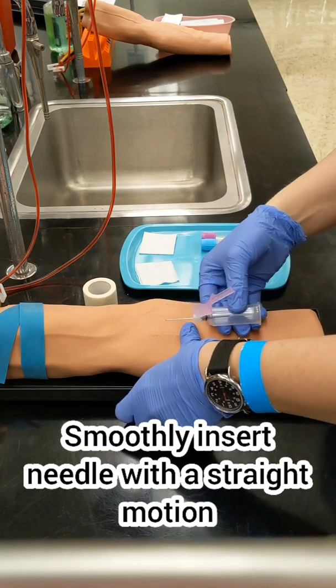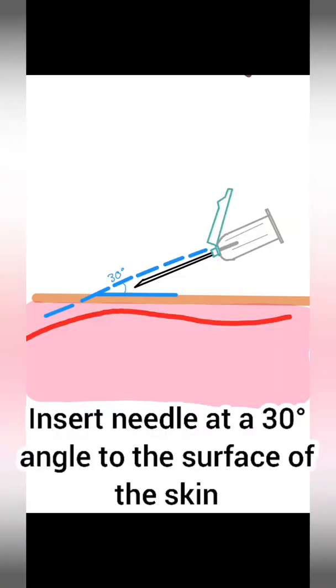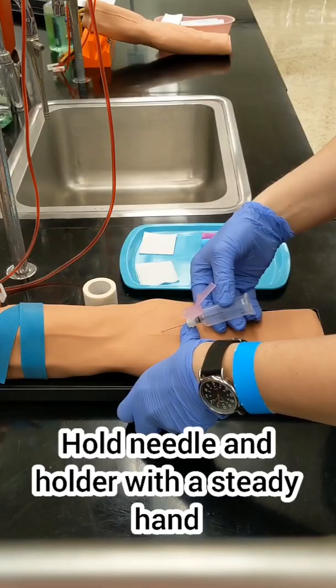The needle should be at a 30-degree angle to the skin surface. If the needle is too flat, you're going to miss that vein. And if the needle is pointing down too much, you will go right through the vein.